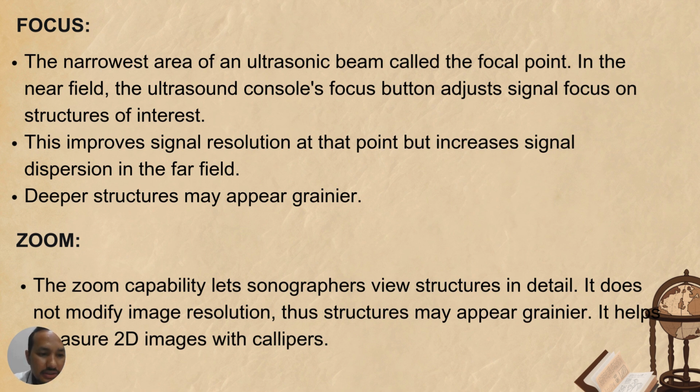And then lastly, for zoom, the zoom capability lets the sonographer view structures in detail. It does not modify image resolution. Those structures may appear grainy. It helps measure with the imaging caliper.